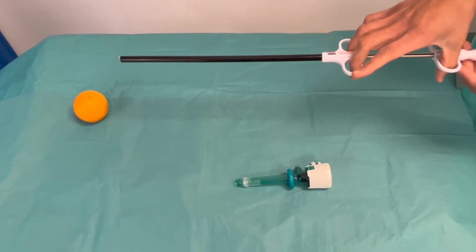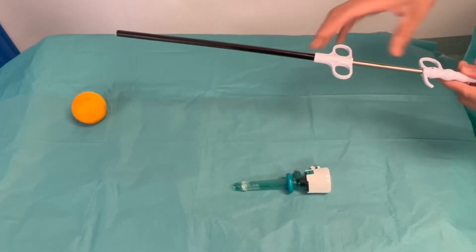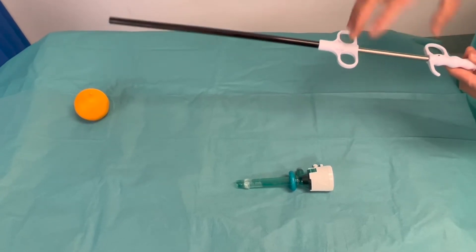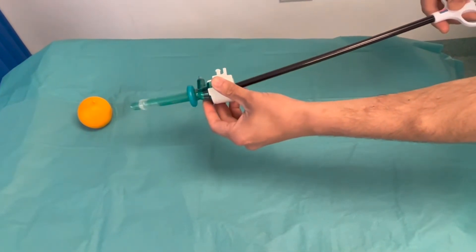You are supposed to face this instrument — the endobag — with the marking facing upwards, and not the other way. With this orientation, the mouth end of the bag will open directly inside the peritoneal cavity.